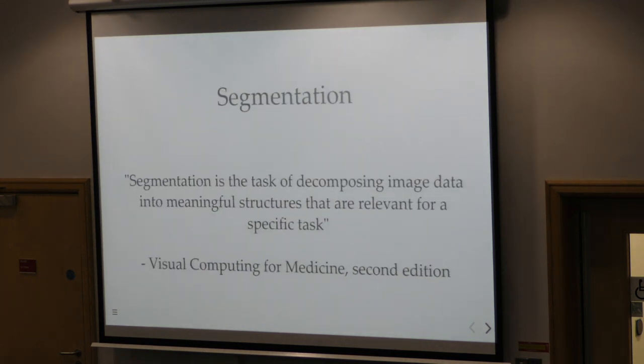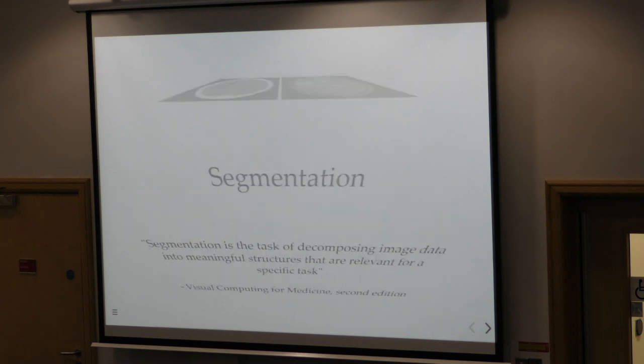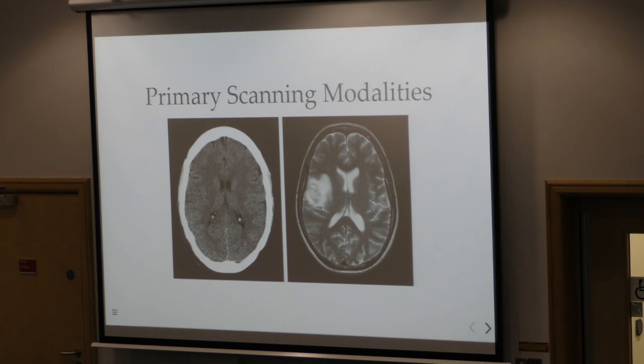I'm sure people are used to the notion in computer vision of picking out an object in an image, just detecting it's there or detecting its boundaries. That's not that unusual a notion, I would think, but it's a bit more of a thorny issue in medicine, because we're dealing with cross-sectional images, and each of these two-dimensional shapes throughout a 3D structure, for example in this case the brain, can look very different depending on what axis and what height you're at.